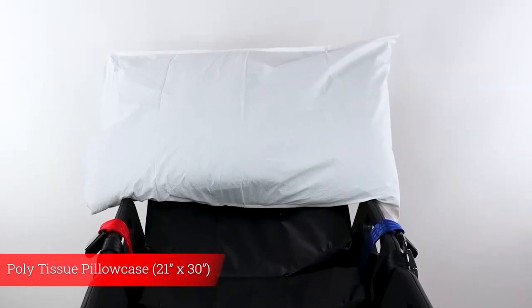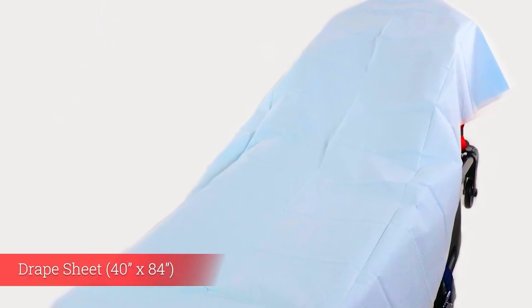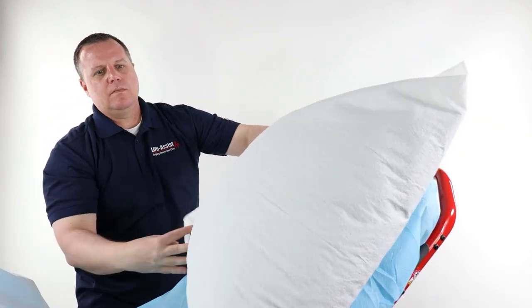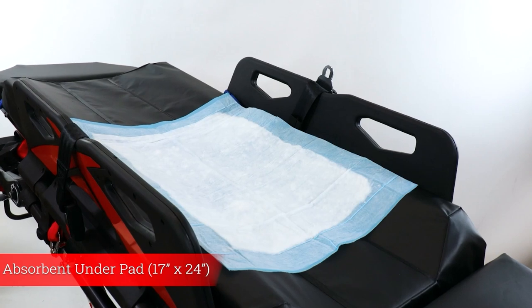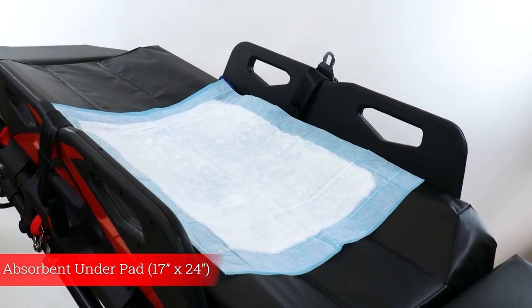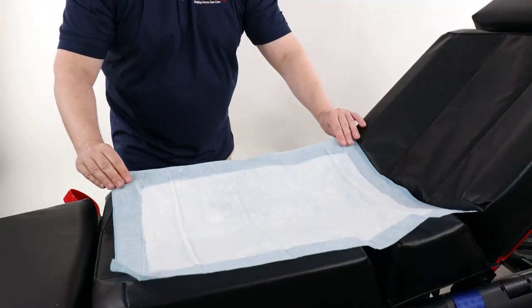A generously sized poly tissue pillowcase and drape sheet accommodates most pillow sizes and ensures plenty of patient coverage. Finally, the extra absorbent under pad provides excellent protection against body fluid and reduces cross contamination risks.